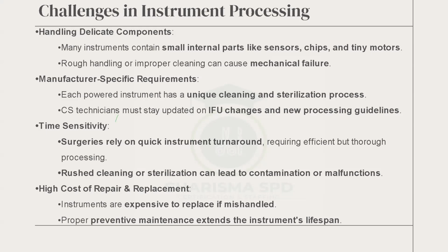Many instruments contain small internal parts like sensors, chips, and tiny motors. Rough handling or improper cleaning can cause mechanical malfunction.